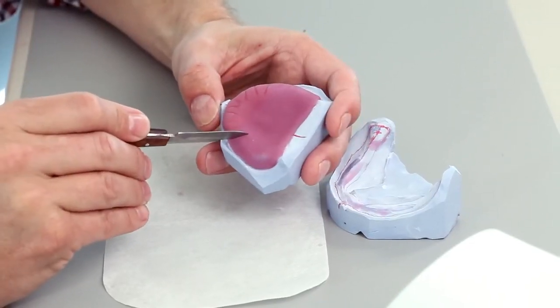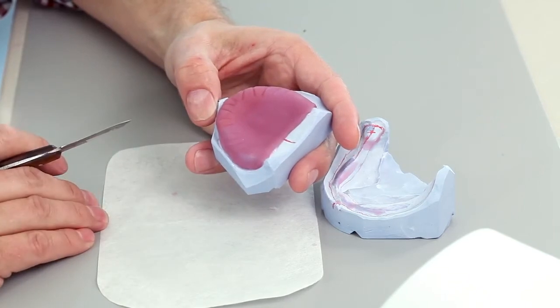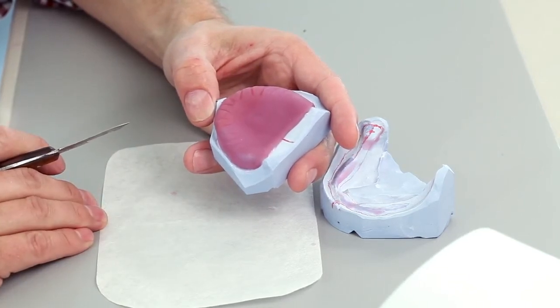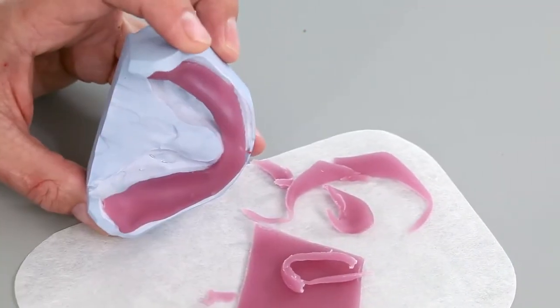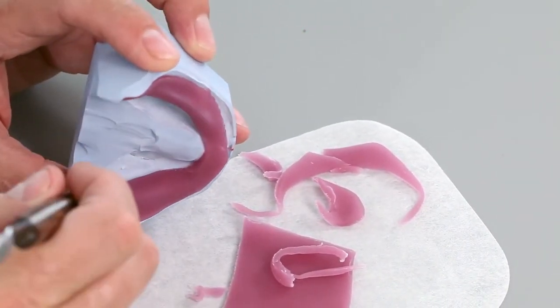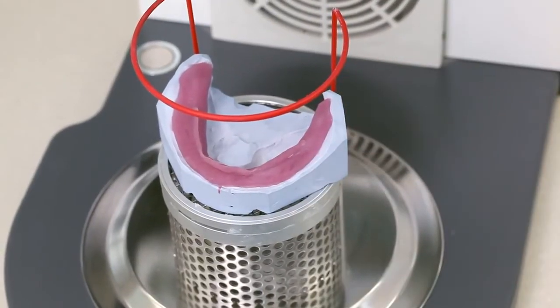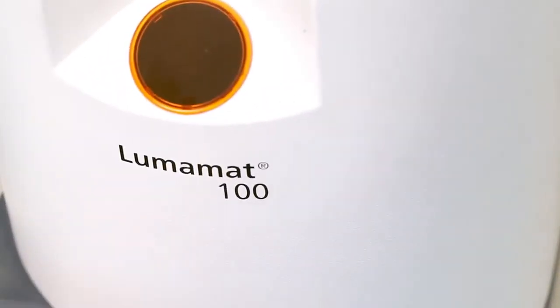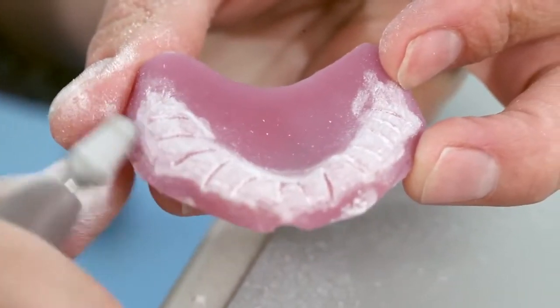To ensure the retention of the bite rim, create a retentive pattern into the uncured acrylic on the occlusal surface of the upper base. In the lower jaw, add a retentive railing to the base as space is limited. Light curing is carried out according to the manufacturer's instructions. Roughen the surface and remove interfering surplus.